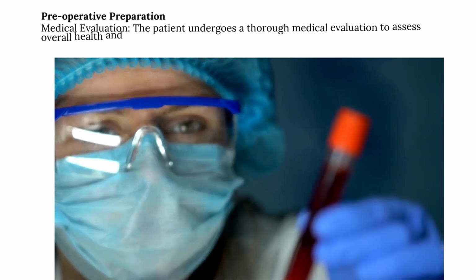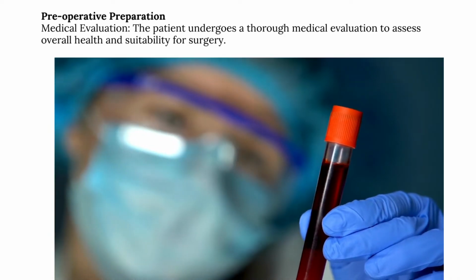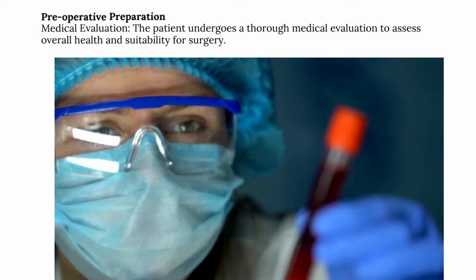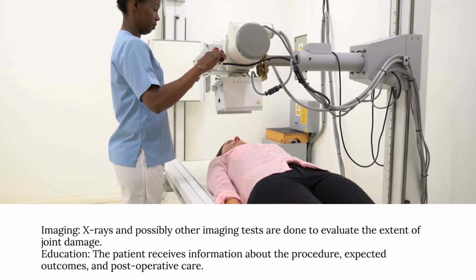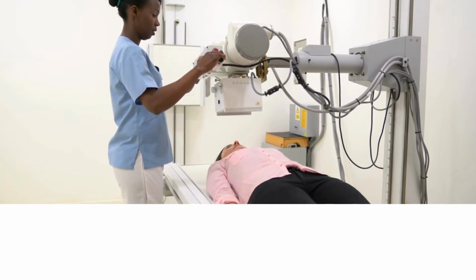Pre-operative preparation, medical evaluation. The patient undergoes a thorough medical evaluation to assess overall health and suitability for surgery. X-rays and possibly other imaging tests are done to evaluate the extent of joint damage. The patient receives information about the procedure, expected outcomes, and post-operative care.